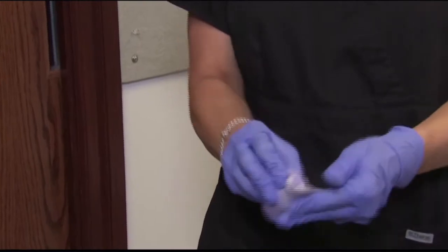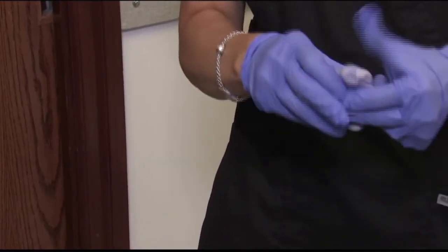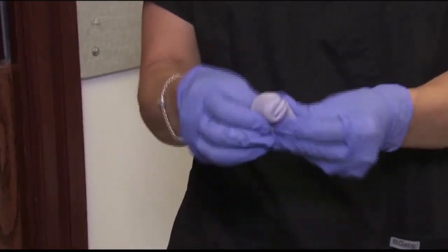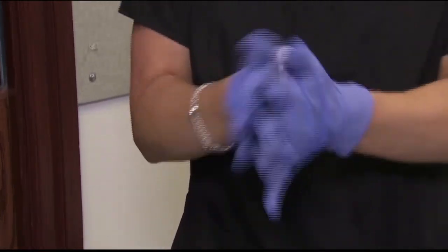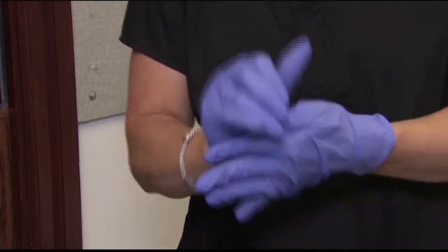So we're going to scoop out a scoop of each. We're going to mix it together. Notice I'm using nitrile gloves. I like to use gloves. These are cranberry nitrile gloves. Really good product. I'm going to knead it, fold it, really mix the material. You don't want to see any swirls. You don't want to have two different colors here. This is purple and gray.